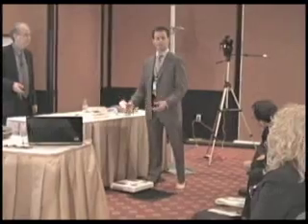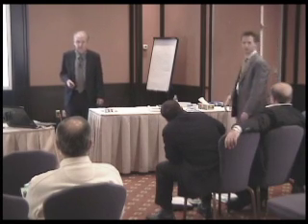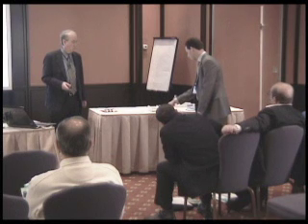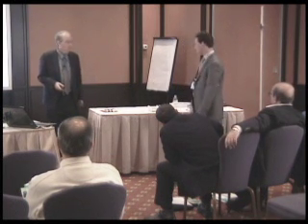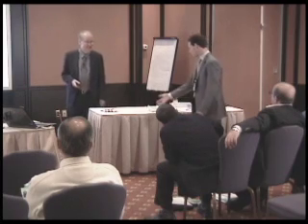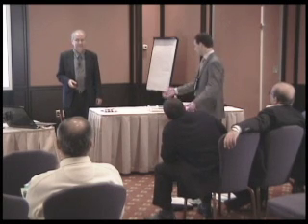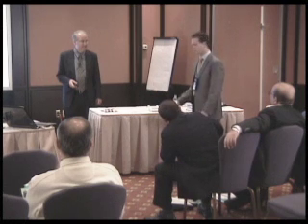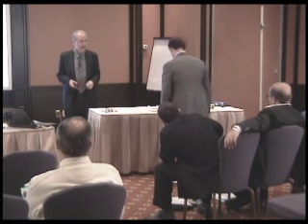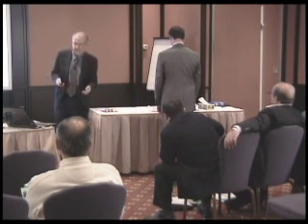And for a more exact height measurement, we also have these statiometers, which will give you a much more exact height measurement when you're actually doing your clinic. I'm going to input my height here. And then it asks for a goal. And I think you were just discussing that. I'm going to put in my ideal. I can choose either a normal or ideal. I'll choose ideal. And the ideal is, I think it's 23% body fat. For this particular individual. Right. And now it's going to ask me to step on the scale. And you would have got that ideal from the chart I was referring to. So, but I think he's fudging it because his results are too good.